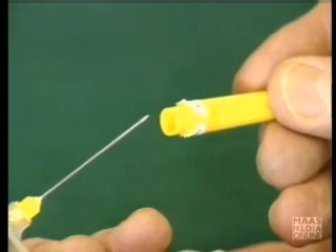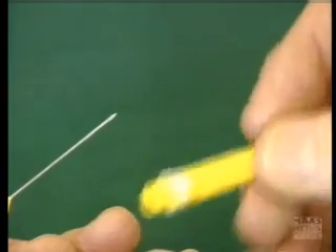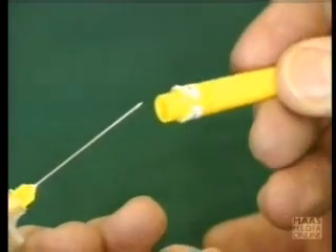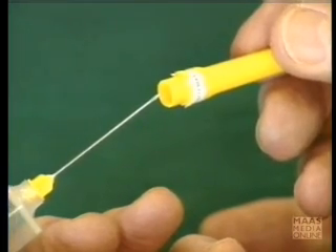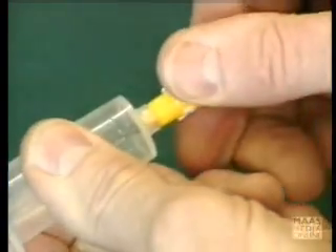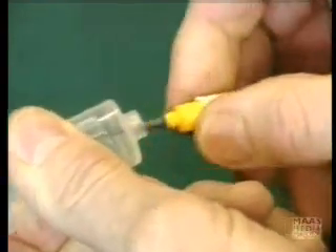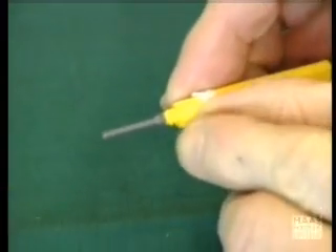Now, I'm going to sheath the needle. This is something you should not normally do once you've actually inserted the needle into the holder, because in doing so you might inadvertently blunt the needle. But I'm going to do this to illustrate something. I'm going to take this needle off and illustrate what happens with this sheath.